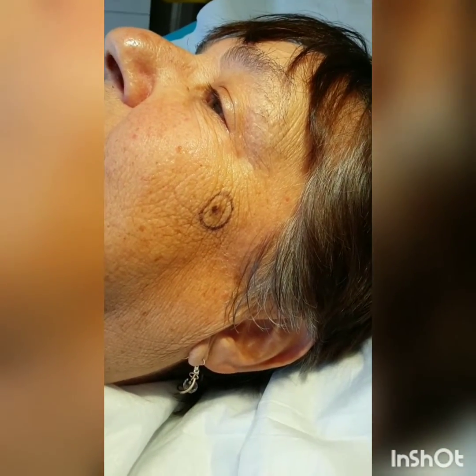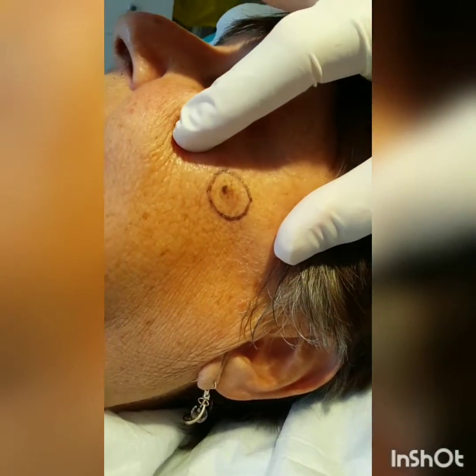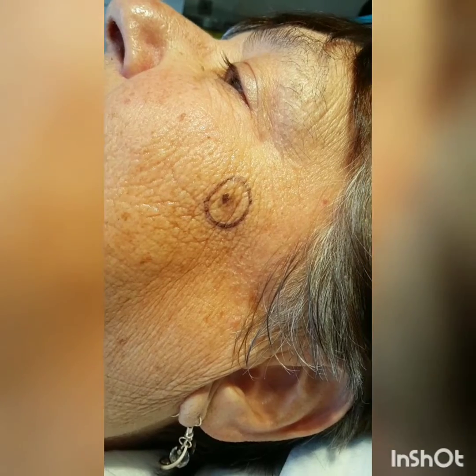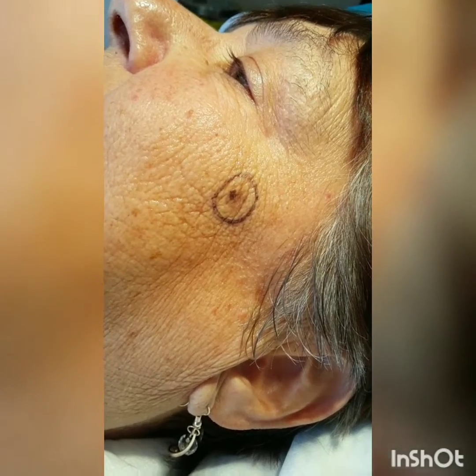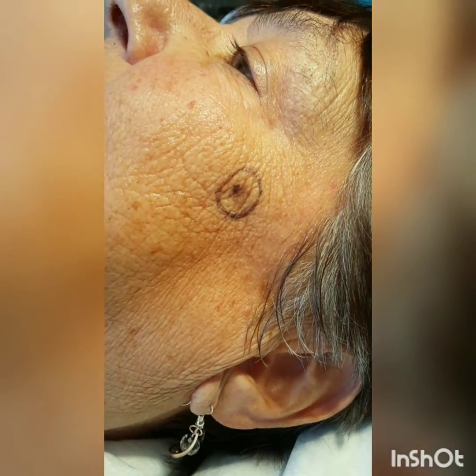Today we have a 70-year-old lady with a suspicious pigmented brown macule on the left cheek. One of our concerns is melanoma, and so what we'd like to do is remove this and send it for histology. Today we're going to do that using a shave biopsy.